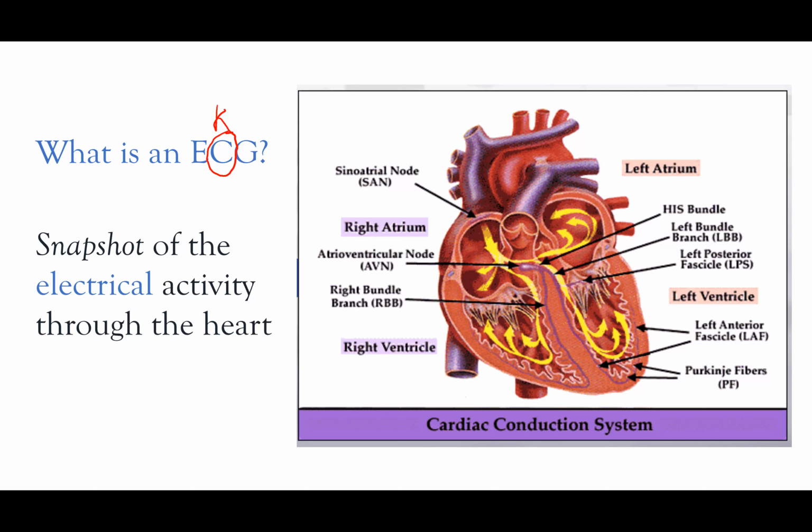And what it gives us is an electrical picture of the heart, or a picture of the heart's electricity at a certain moment in time. So it gives us what I've labeled here a snapshot. And I think this is really important because often the patient comes to see you and they say, oh, I had chest pain yesterday. Well, if you get an ECG today and they're not having any symptoms, chances are the ECG may look normal. And that's because you're just getting a snapshot.